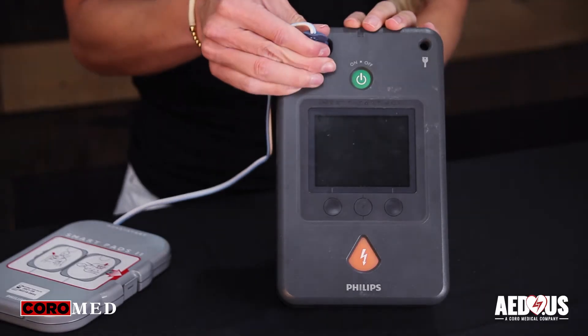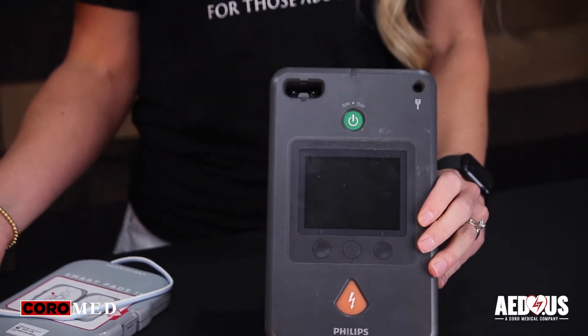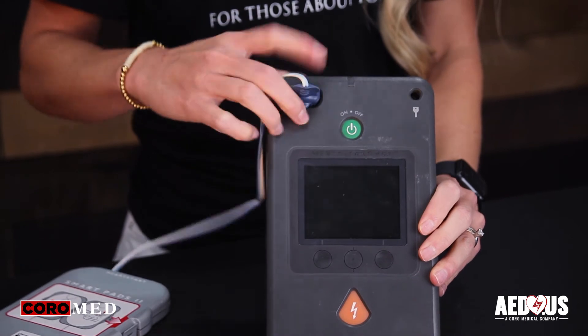To install or replace the adult electrodes, open the case if you have one. Carefully unplug the connector and remove the expired pad. Take the new pad out of its packaging and place it securely in the AED.